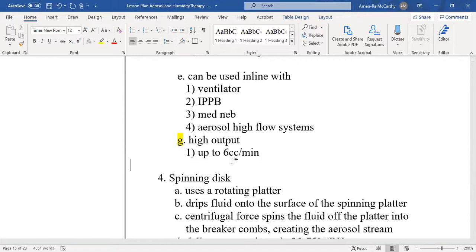That's sputum, all right? Now, the reason why we want to induce sputum, guys, is if I want to go test it. If I'm not sure, my patient comes in with a fever, coughing, short of breath, right? When I'm the doctor, he's coughing up yellow stuff, the doctor is going to say, well, I want a sputum sample from him, right? And if he can't cough it up, I can put an ultrasonic nebulizer mask on him and he'll breathe all them particles in, see? And that'll loosen up that stuff real good so he can produce a sputum sample for me. He'll spit in the cup, seal it off, and send it to the lab, okay?